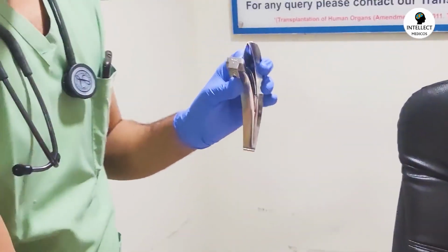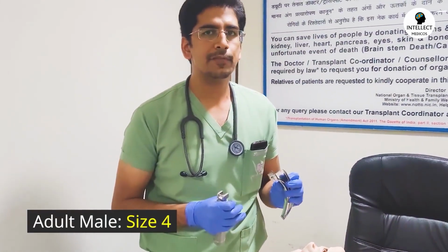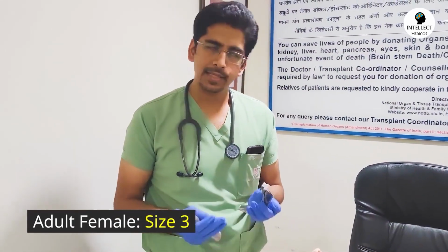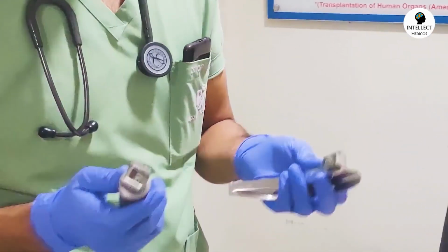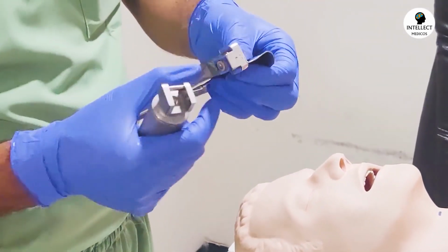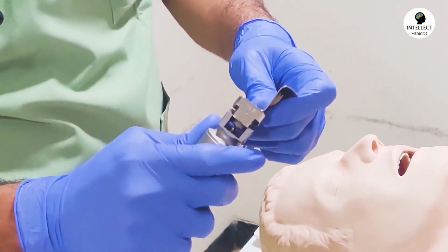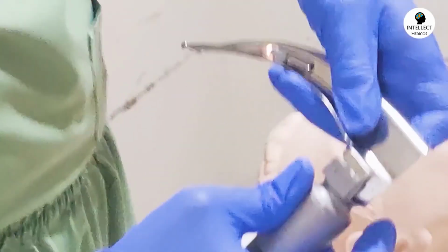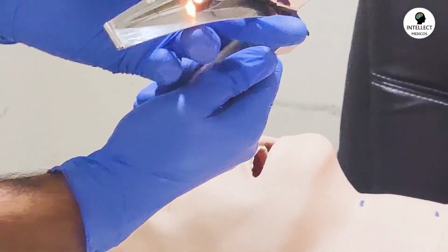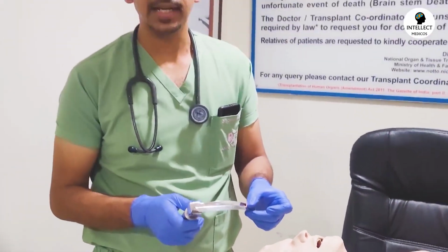In an adult male patient, we prefer to use Macintosh size number 4, whereas in an adult female patient, we prefer to use size number 3. But then again, it depends on the anatomy of a patient. Now, how to use it? This is a very important step. There is a groove over here in the handle, and you just have to insert this blade like this, and then straighten it like this, and there will be a light. Now you need to see whether this light is adequate or not. How to check it?